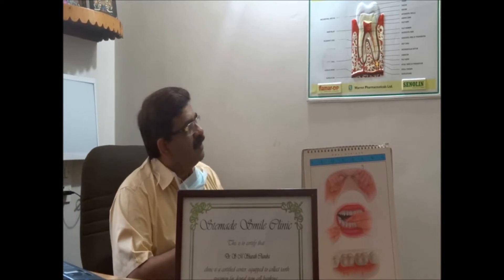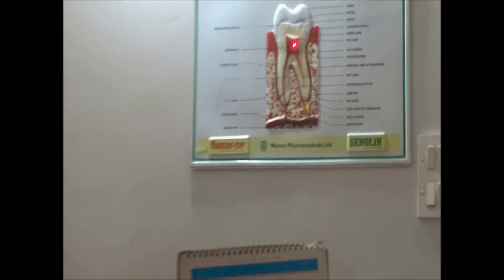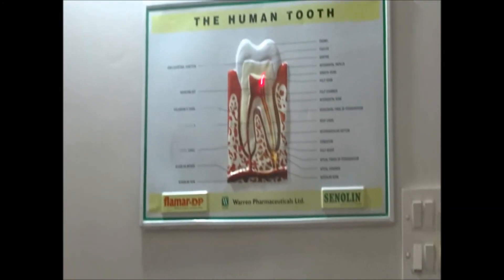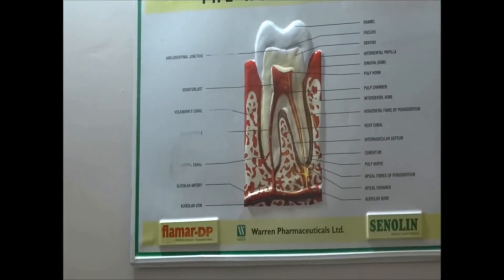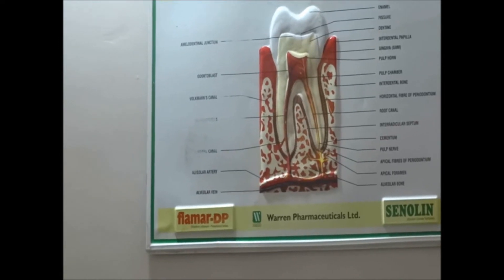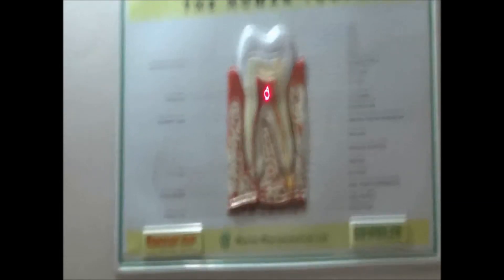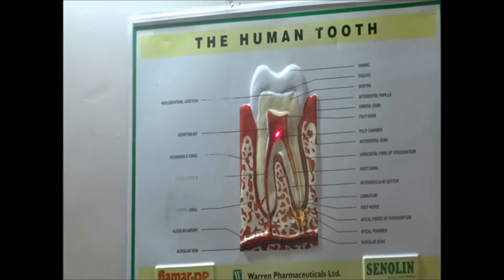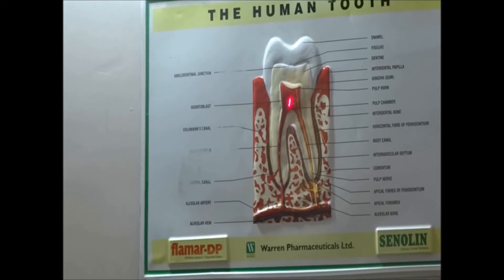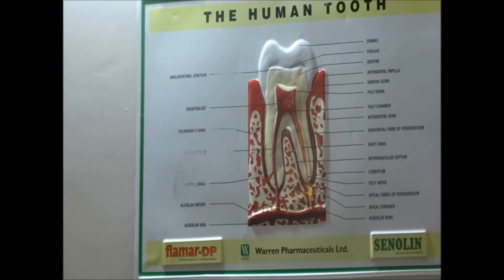Generally we carry out root canal treatment in three sittings. In the first sitting we establish access into the pulp chamber and determine the length of the root with the help of radiographs or apex locators. We then place a dressing in the pulp chamber so that any infection within the root canal can be addressed by the dressing over the next two to three days.